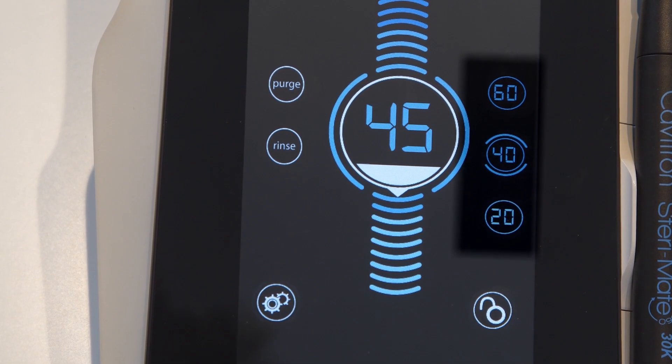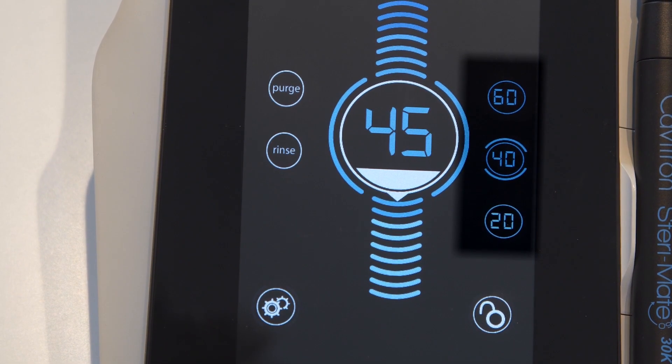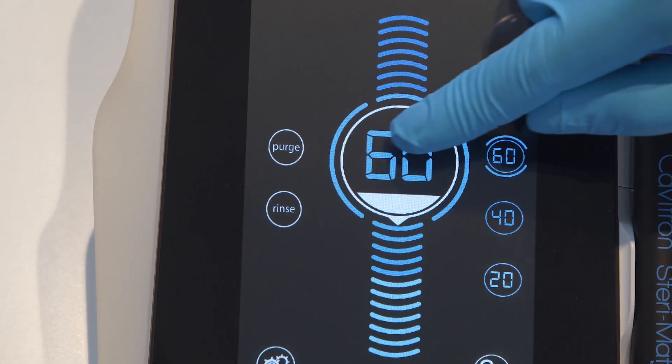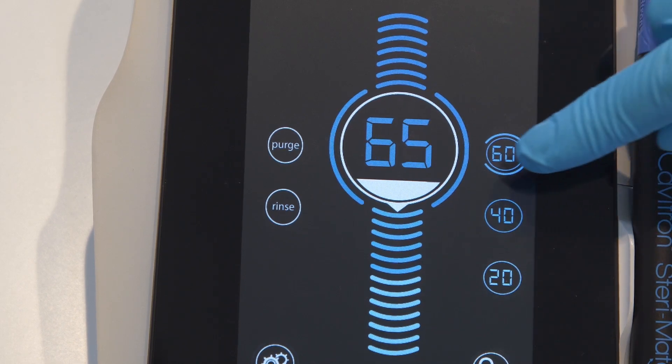The right side of the screen contains three preset power settings that come factory set to 20, 40 and 60. However, these can be reset to any level desired.